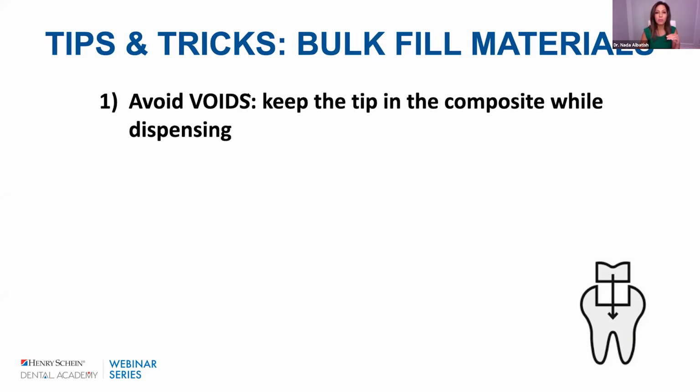If you incorporate air bubbles into your adhesive, into your flowable layer, or into your packable layer, you're risking, in a lot of places, your patient having postoperative sensitivity. And it's the kind of postoperative sensitivity that feels like biting pain in someone that's not really having nerve pain. So if you've ever placed a restoration, had a patient with biting pain, and you haven't been able to figure out what's wrong, most likely you've got an air bubble incorporated somewhere and you just need to replace that restoration. Endo is actually not the answer. I mean, of course, endo will fix it, but it's probably over treatment.